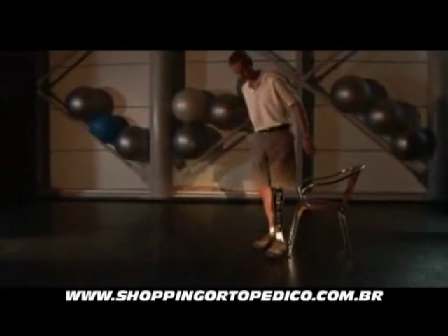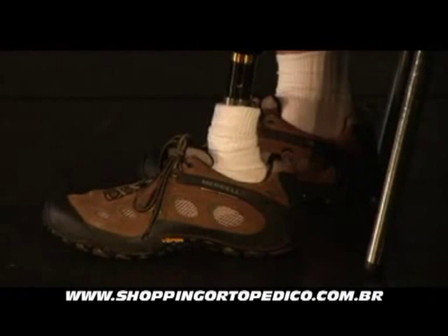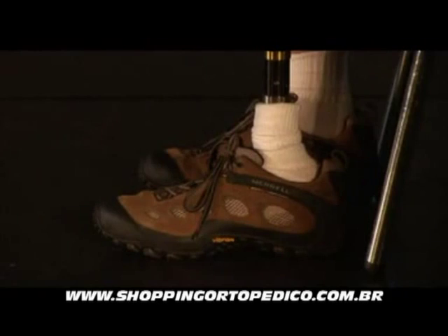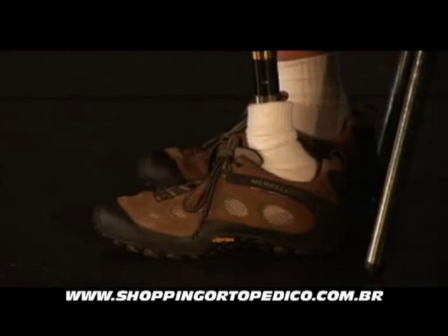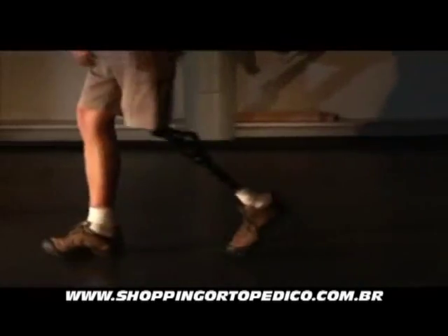Under the same circumstances, Echelon adapts. As the foot stays flat, there is less strain on stump and muscles and a more stable platform for a subsequent rise and walk away. The adaptive quality of the hydraulics means that it can generate different forces at different angular positions.